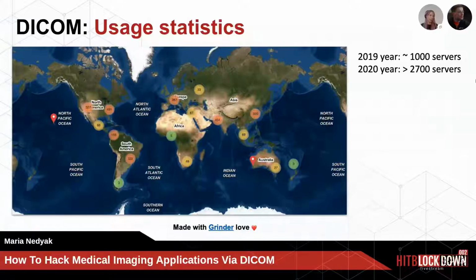And now all 2,700 servers are available on the internet, and also an interesting fact is that about 700 of these servers allow you to connect to them without any application entity title, and you can just go and take images, and that's it. Wow. Okay, that sounds bad.